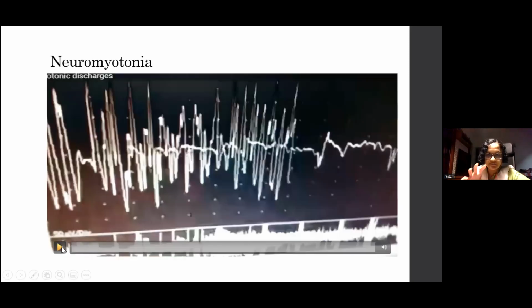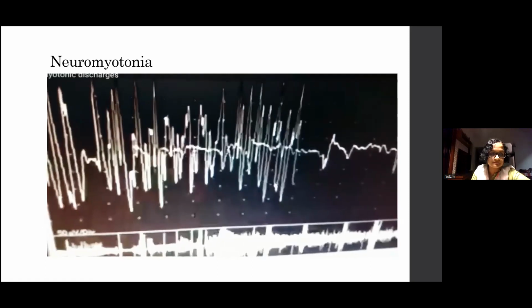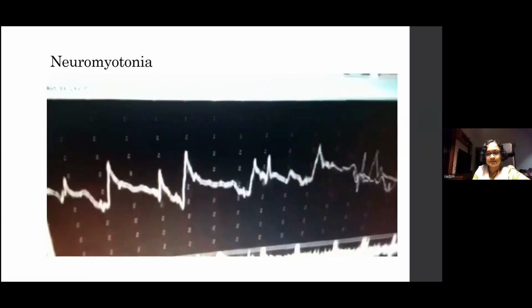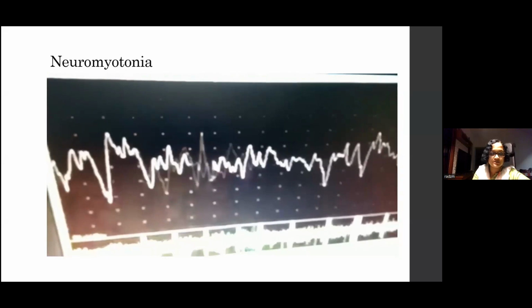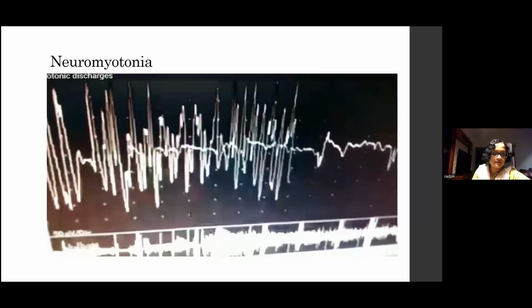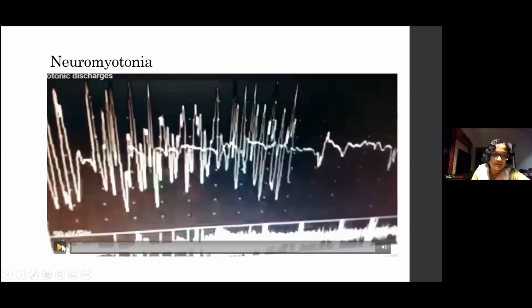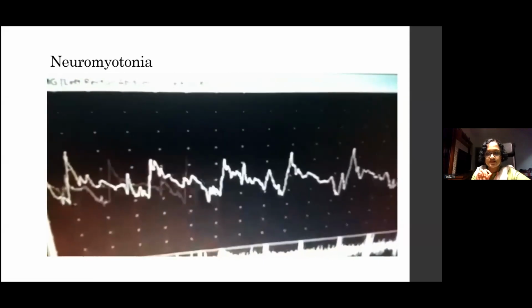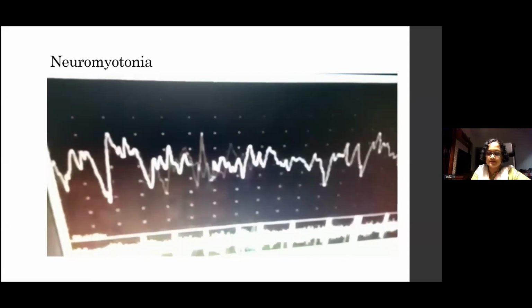There's going to be a lot of noise at the start of this video, and then later, as it settles, you're going to hear that high-pitched sound. So just watch out for that. That's neuromyotonia. It's such a high frequency. Okay, let's do that again. Sorry, I'm just trying to play that once more. That's high frequency, and that's what you need to watch out for when your needle is in the muscle.